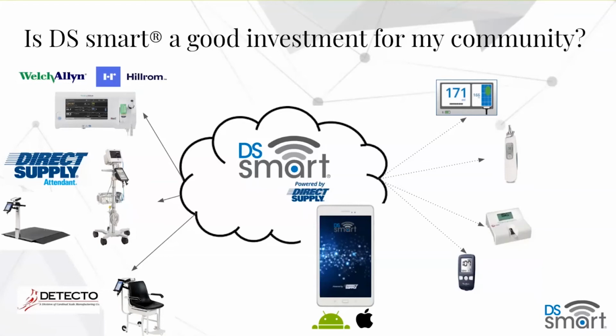In the future, we really want DS Smart to be a platform system that allows you to accommodate for the ever-changing needs that your community is going to face. And on the right-hand side, it gives you a great example of some of those future products that we are looking to bring into that ecosystem to be able to allow you to continue to build out and really get a good investment on the community's money that they're spending investing in DS Smart. Some examples of the equipment that's on our roadmap are bladder scanners, glucometers, and standalone thermometers. So some of those standalone pieces to add to your baskets and things for your vital solution.